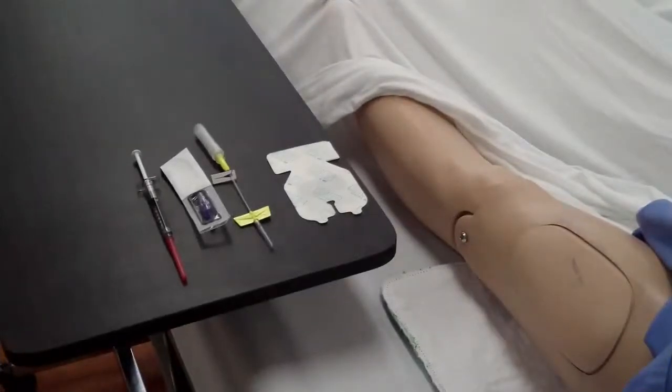You are now ready to insert the butterfly. Ensure that you have your prepared medication, the microclave connector, the butterfly, the dressing, and alcohol wipes.